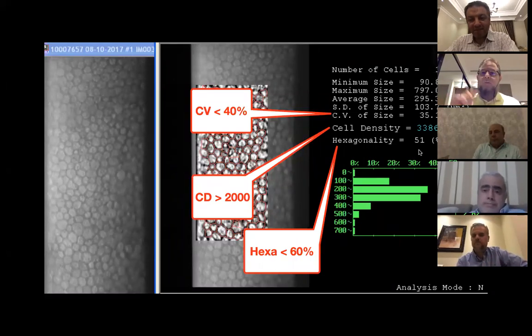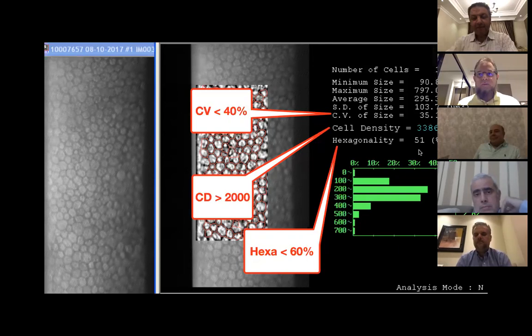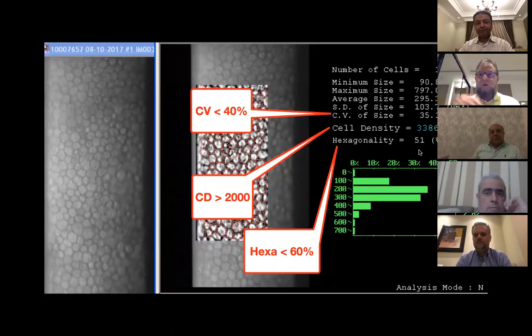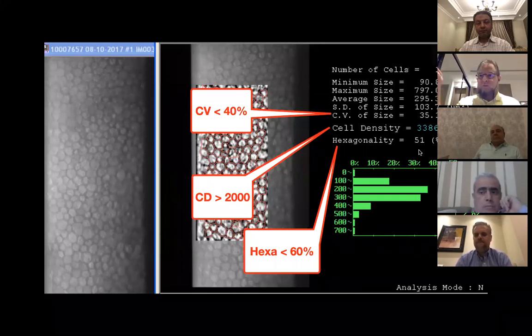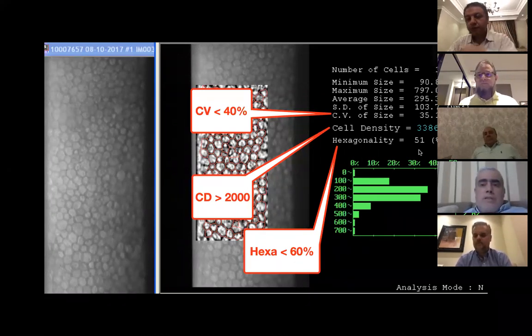Very good question, doctor. Whenever I see a cornea thicker than 600 microns, I have to doubt. Whenever I see any abnormal appearance of the cornea on the slit lamp, and whenever I see a flat or almost flat thickness profile on the spatial thickness profile, I have to think about cornea guttata or Fuchs dystrophy. So these three things. And whenever I find that there is Fuchs or guttata, I don't do laser-based, I don't do lens-based. It's not a refractive surgery patient at all.